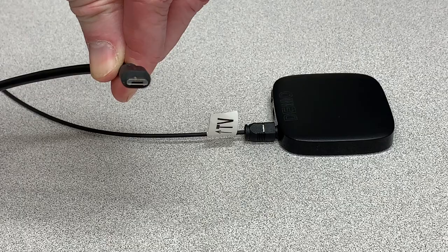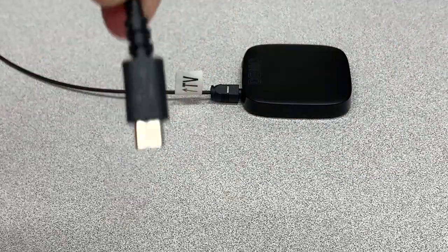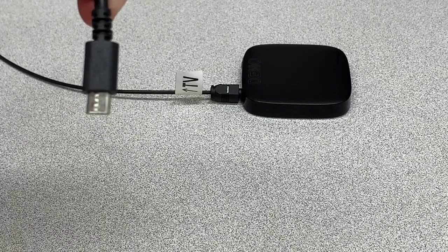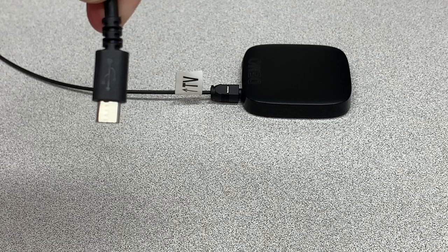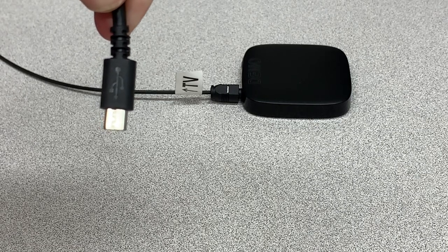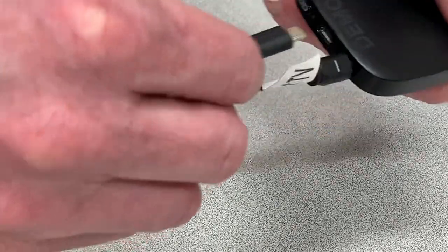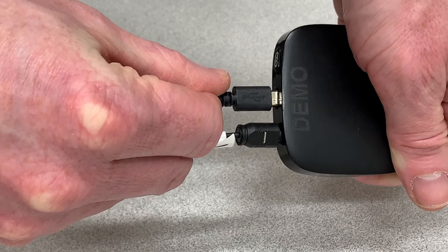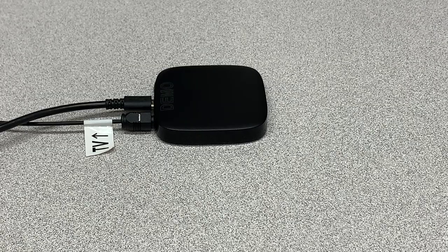You'll see the power cable also has a specific shape to it, so make sure that you line that up correctly. You'll notice there's a USB symbol on the part of the cable that faces up, so when you plug it in, that USB symbol is going to be facing up. Now just connect the other end to the power supply.